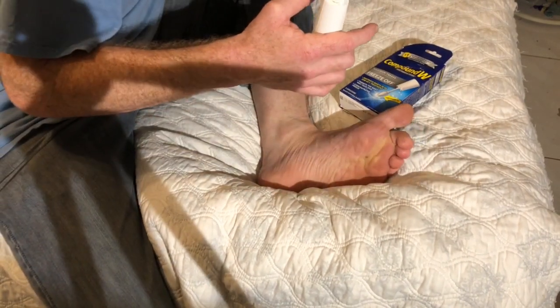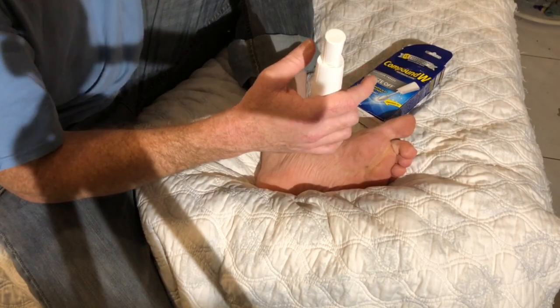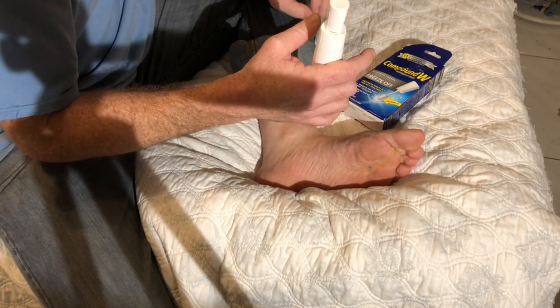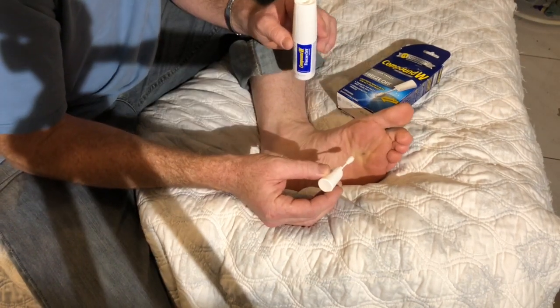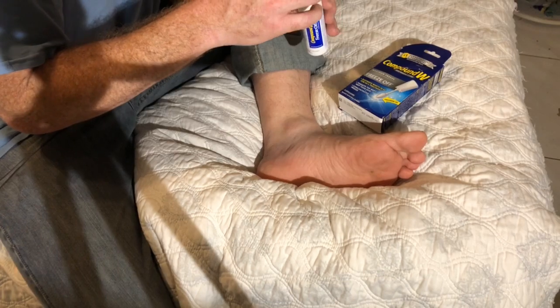Hold it down until you hear a hissing sound, then continue to hold down for two to three seconds. Release the handle, wait 30 seconds, then remove it, put it on, and hold it for 40 seconds.